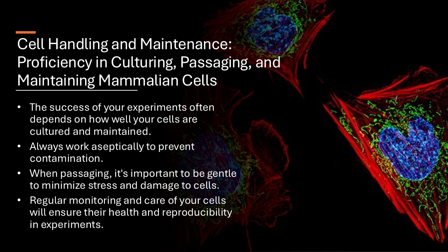What are the essentials? Well, first off, we need to get the temperature just right. Okay, that makes sense, keeping them comfy. But I imagine it's more than just a temperature-controlled room. Oh, definitely. Think of it like making a recipe. They need the right ingredients to thrive, and that's where the culture medium comes in. Culture medium, like their food. Exactly. It's a special liquid packed with all the good stuff. Amino acids, vitamins, salts, glucose, you name it. It's like their all-inclusive buffet.